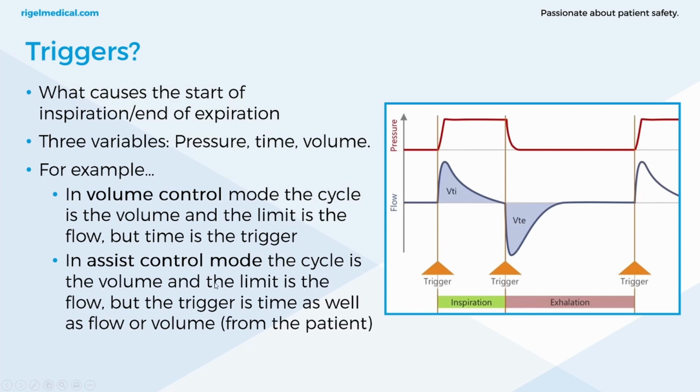The limit is the flow. So the upper limit is the flow, but it could also be the pressure. So your limit here could be pressure. And then the trigger is either time or it's the trigger from the patient, which is the flow or volume.